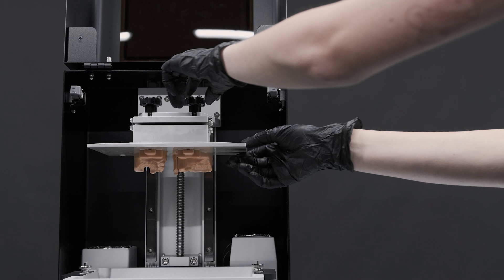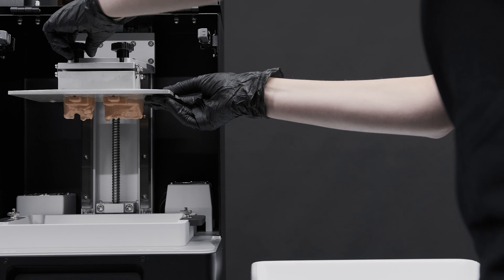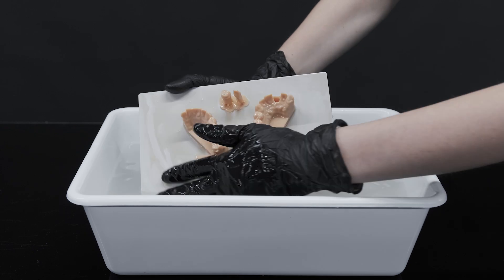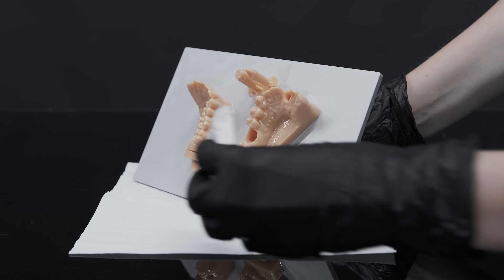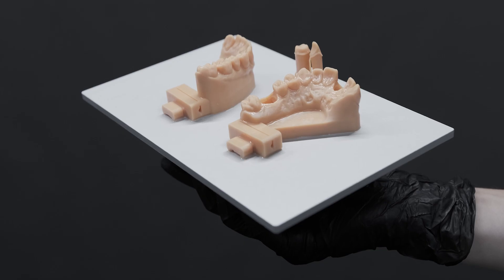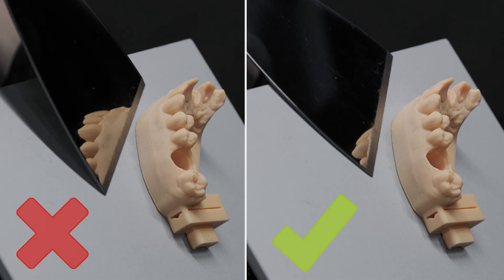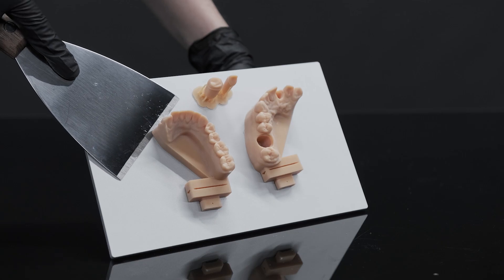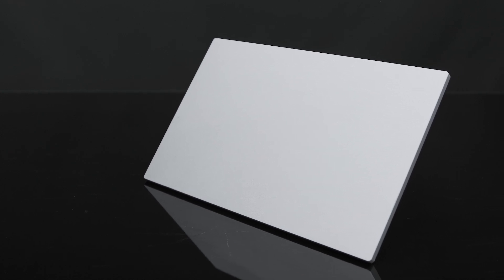Once the printing process is completed, remove the printed objects carefully to prevent any accident or damage. After removing the building plate, wash the models in a bowl full of water and then clean the plate using a tissue. Once finished, slide the metal scraper under the model with not too much inclination and with the smoothed edge facing upwards. Remove the model without putting pressure on it to avoid distortions. Finally, check for any traces of cured resin on the building plate.